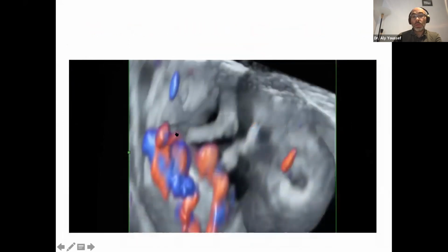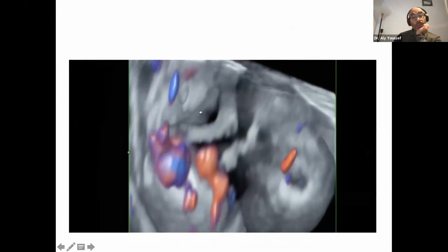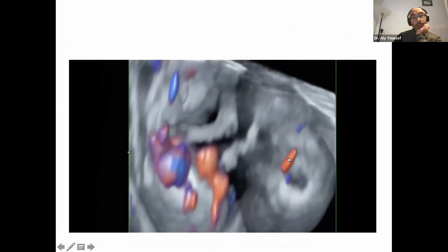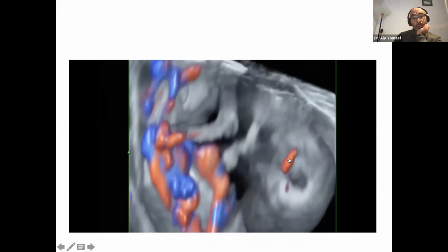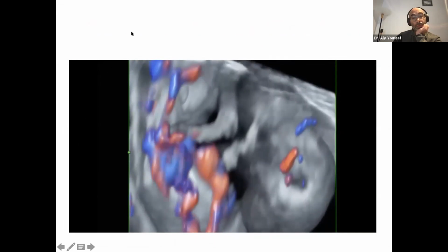And this is a 3D glass body reconstruction. On the left-hand side is the small, normal baby with a normal circulation and heart, and the other mass, which is only perfused passively from the normal fetus.